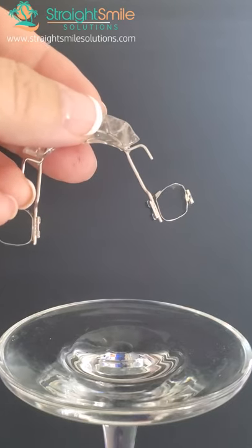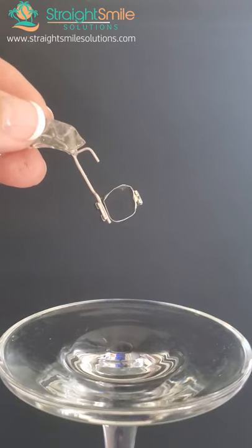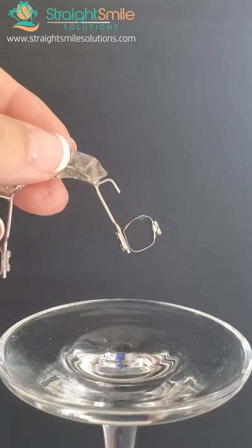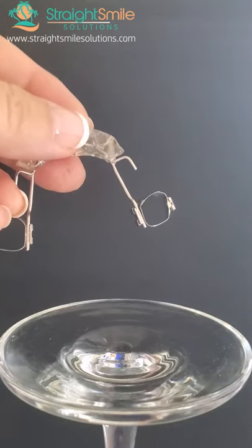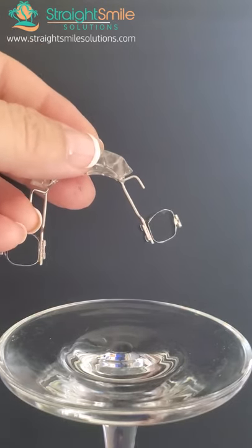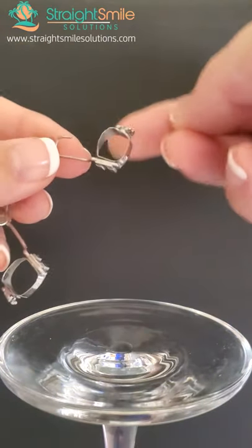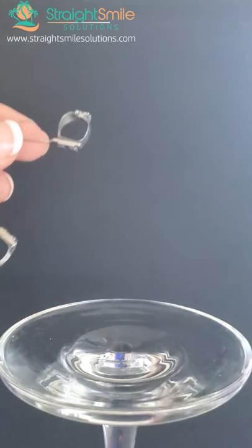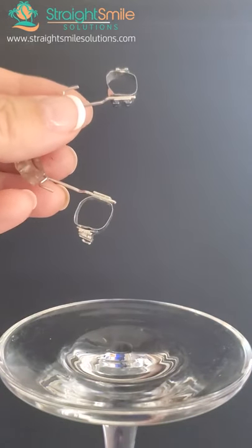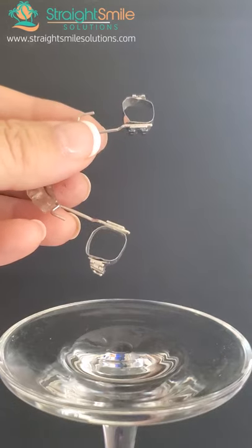You send in the scan or impression. I usually recommend throwing the spacers in first and taking them out before you do that, so the lab can fit the bands better. If you have bands in stock, you can fit your bands first and do a pickup impression, but this is a lot easier — you don't have to worry about stocking bands. It comes back to you like this. You go ahead and put your band glue in, thin layer. My favorite band glue is made by 3M Unitec — it's called Bandlock, B-A-N-D-L-O-K.